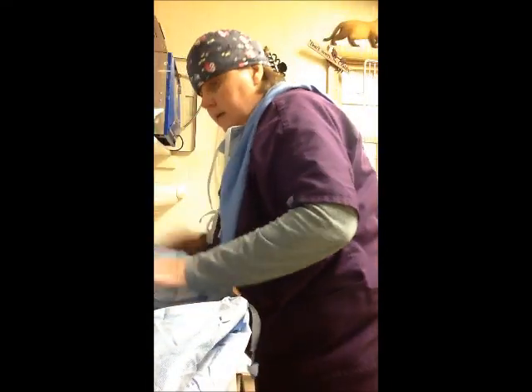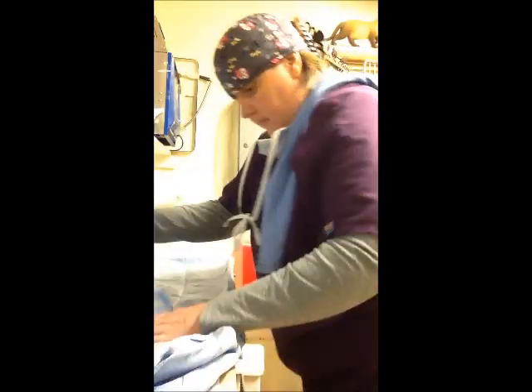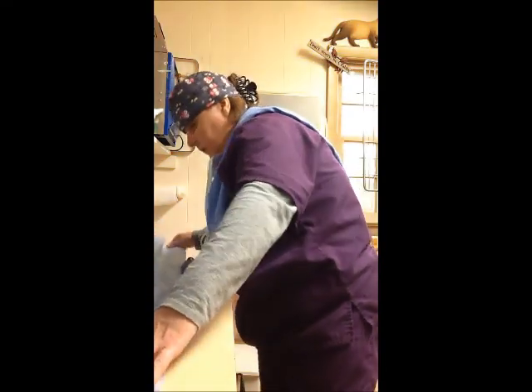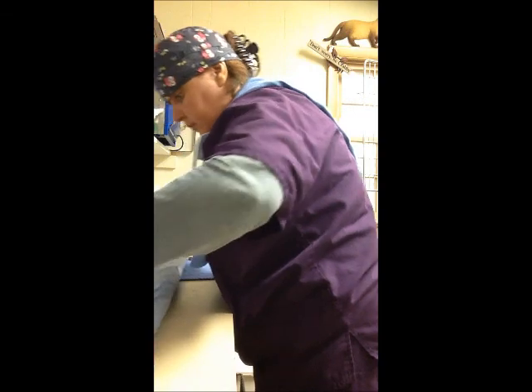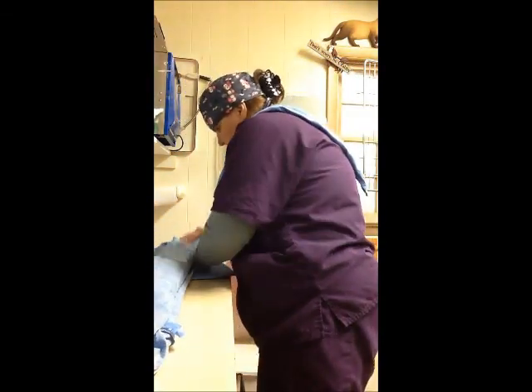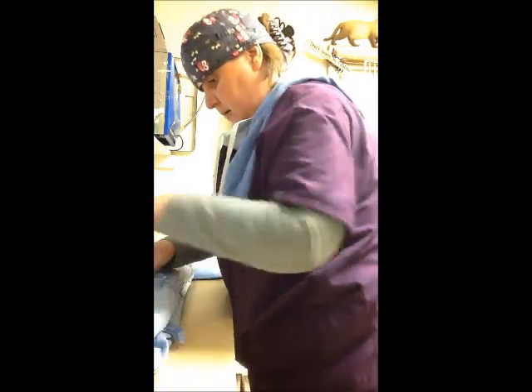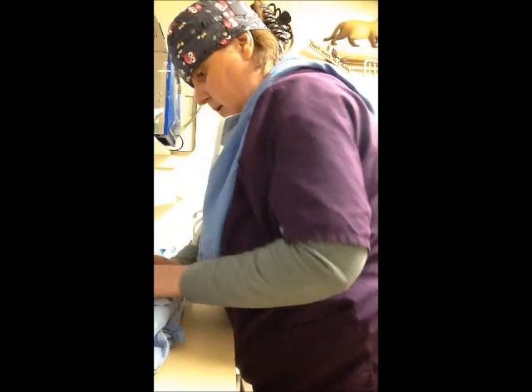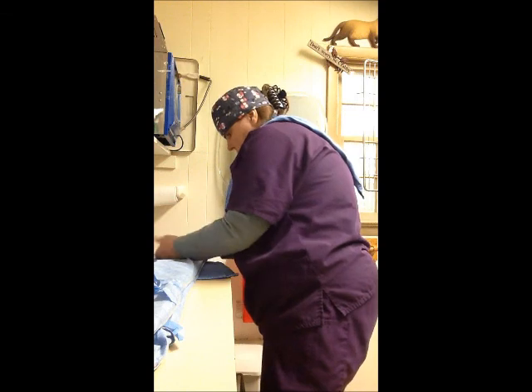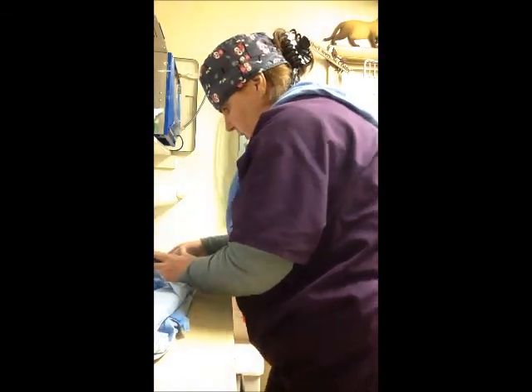Everything just has its place. It's very flattened. And then we will fold this side in like this, and the other side right under. We'll fold this side in like this. Okay, and then we'll have an accordion in the other direction. So accordion this way, this way.